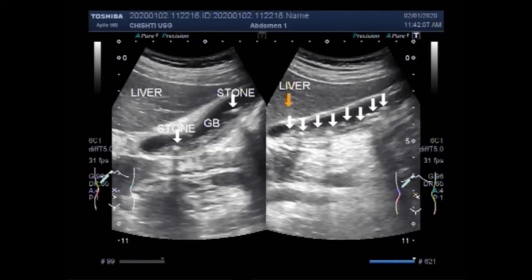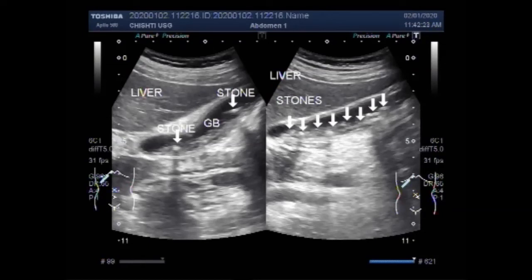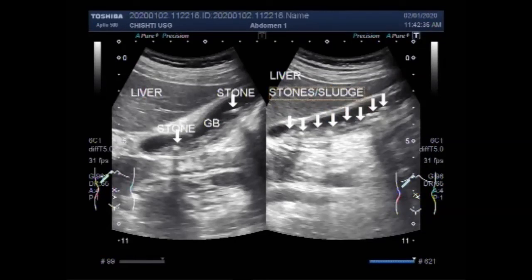So the gallbladder has a mixture of small stones, sand particles, and thick sludge. These stones are present along with thick sludge throughout the whole length of the gallbladder, and these stones may change their position by altering the posture of the patient during the ultrasound examination.